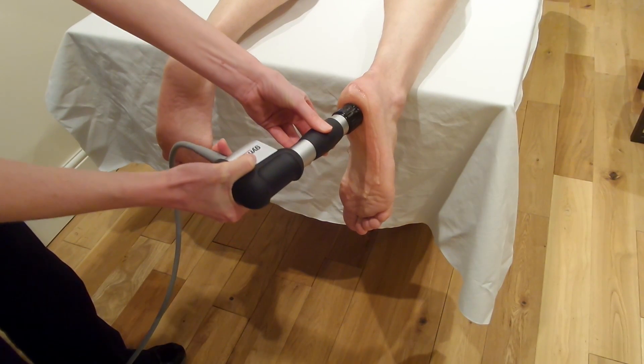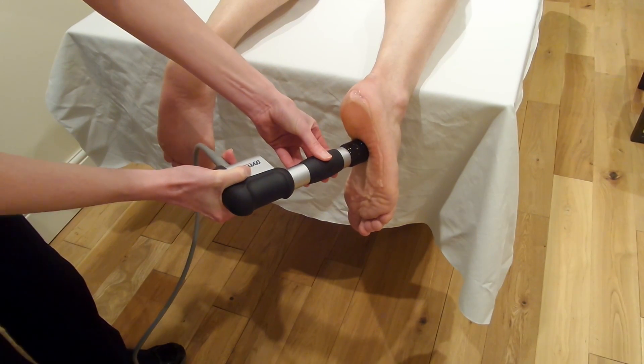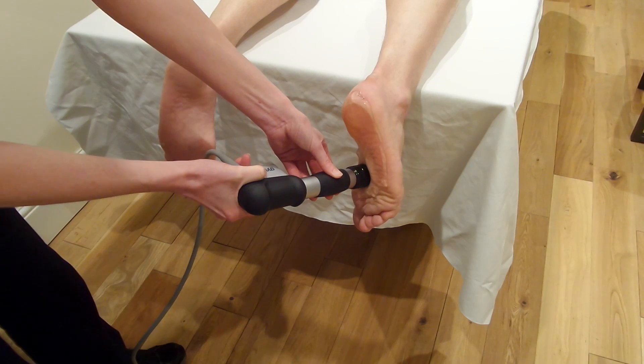I wouldn't necessarily put the foot up onto the bed and do it that way — it really does put some pressure down through the leg and might not be the most appropriate thing to do, although it does keep the foot a little bit stiller.